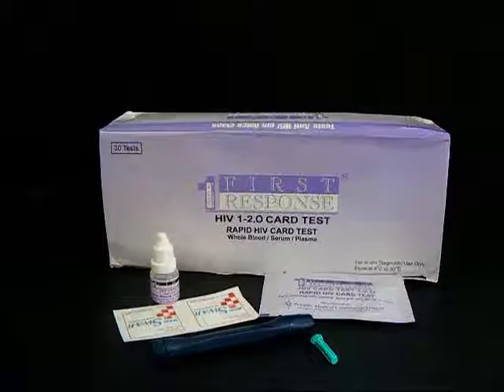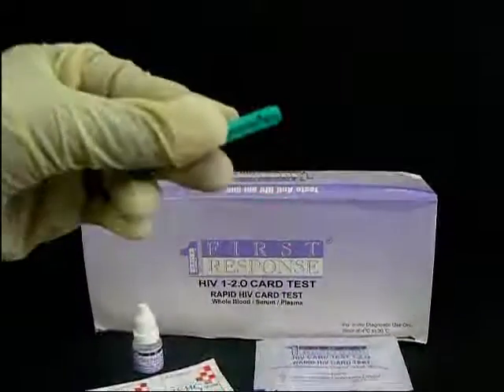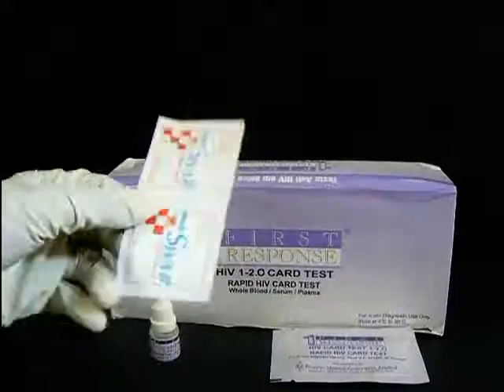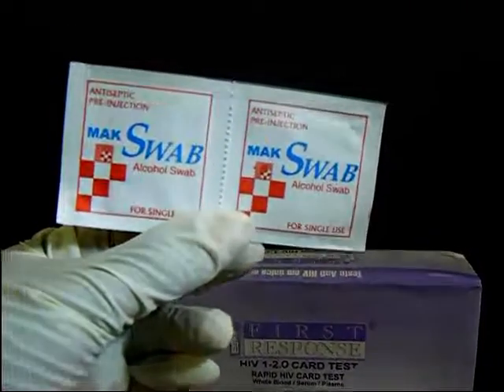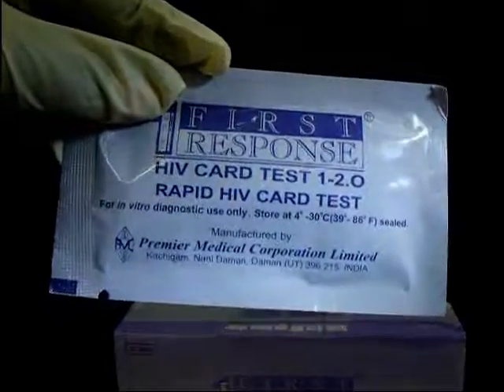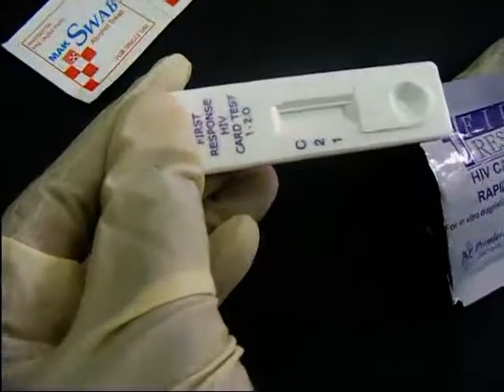The First Response HIV 1 and 2 kit contains a lancet holder, a lancet, a clean alcohol swab, HIV card test assay diluent, and a pack which contains the test device and a pipette for picking blood.